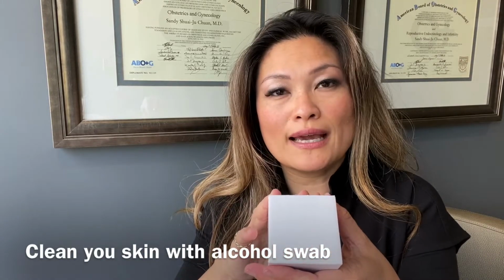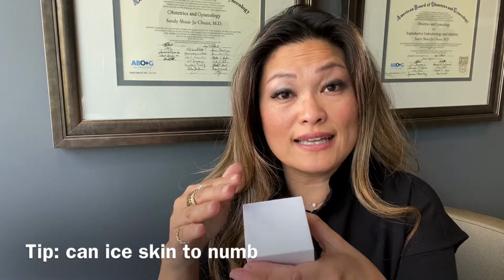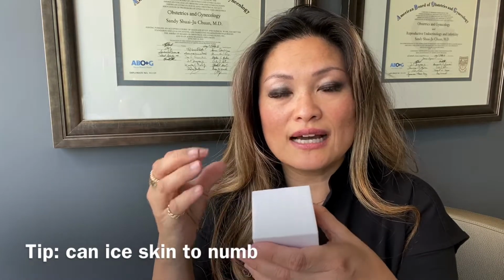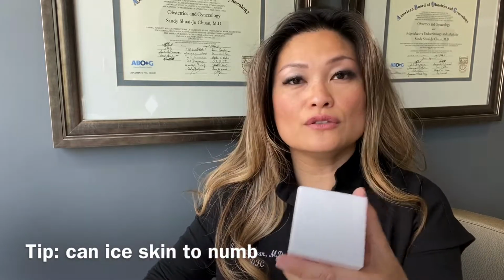Another little tip that I have for patients is that if you're nervous about that first injection or feeling that little prick, go ahead and ice the area. Get a little ice cube and keep it on there for 10-15 seconds. Ice is really good at numbing the skin. And then after you ice it, you have to clean it.